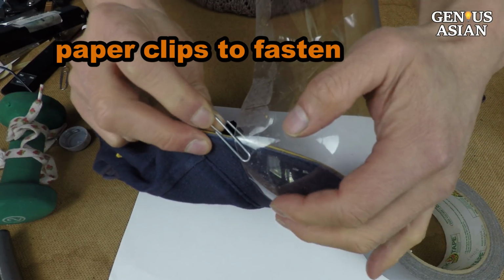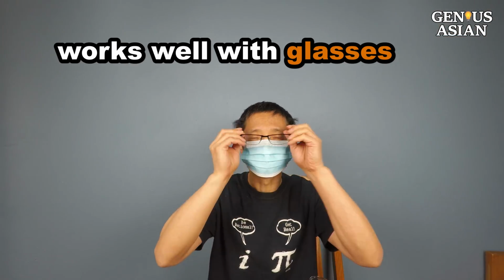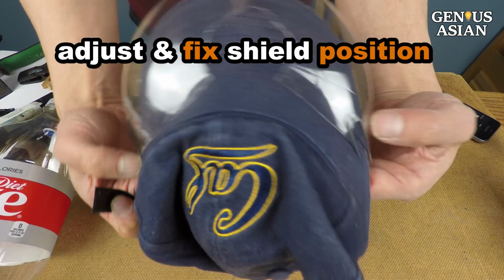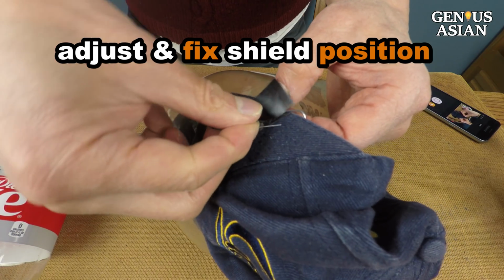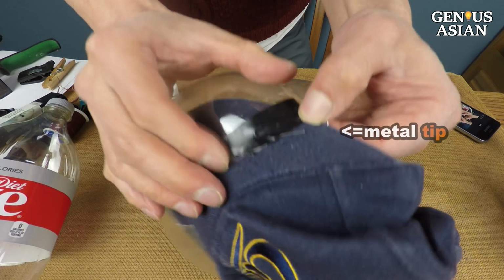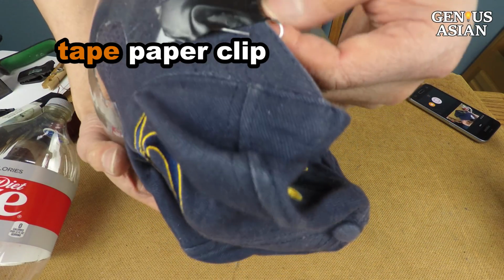I use a couple of paper clips to fasten the shield to the cap. Now, see, with glasses, it works pretty well. Once you adjust the shield to your satisfaction, you can fix the shield position securely as follows. The metal tip of the paper clip has to be touching the cloth brim of the cap so that the shield latches. Then I use tape to secure the paper clip to the shield.